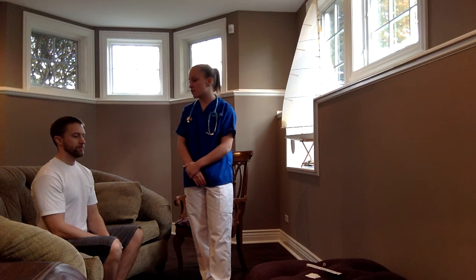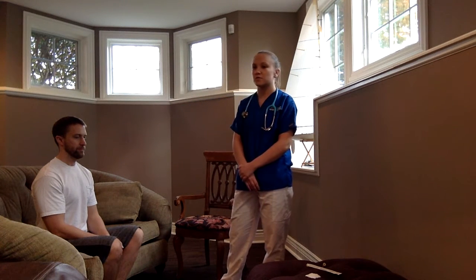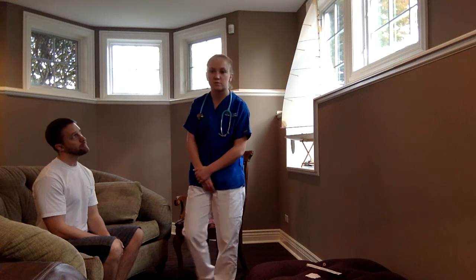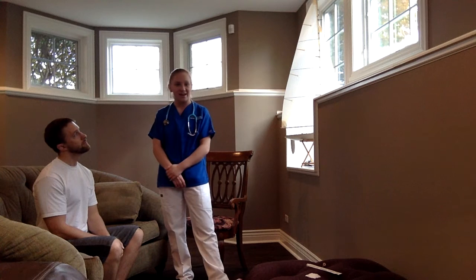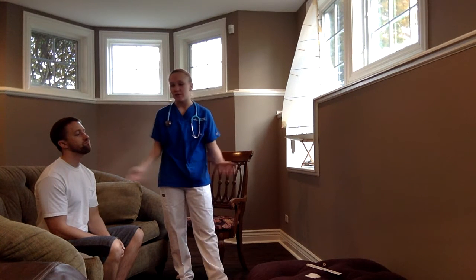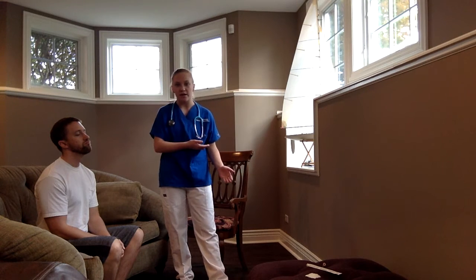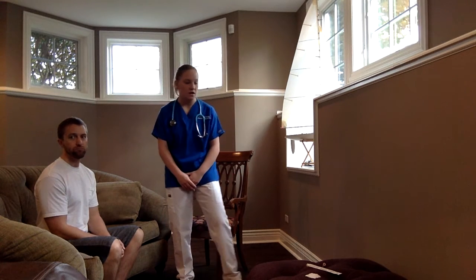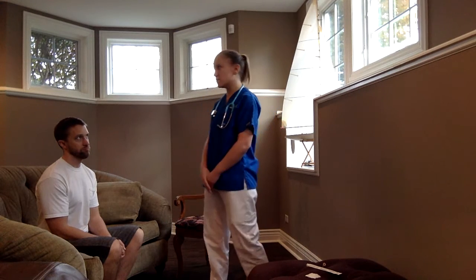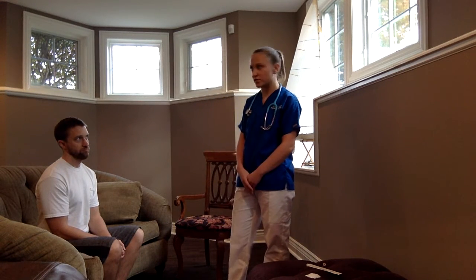And then now I'm going to be verbalizing his height and weight, and I'm going to be using those two numbers to calculate his BMI. And then I'm going to test for his visual acuity using the Snellen eye chart. That is when I'm going to have him stand 20 feet across from the chart and see what line he can read. Based on his correctness, I can calculate his vision score. And usually 20/20 is a normal vision.